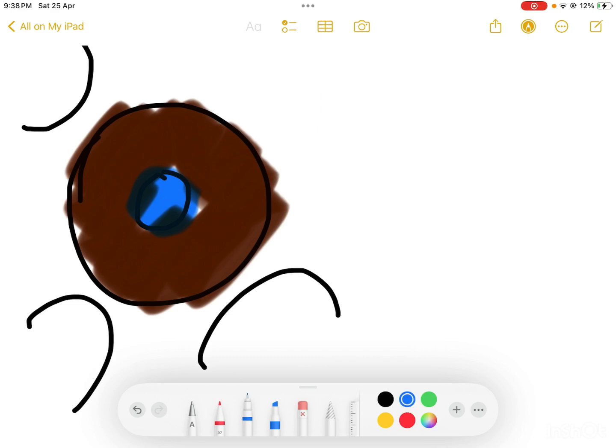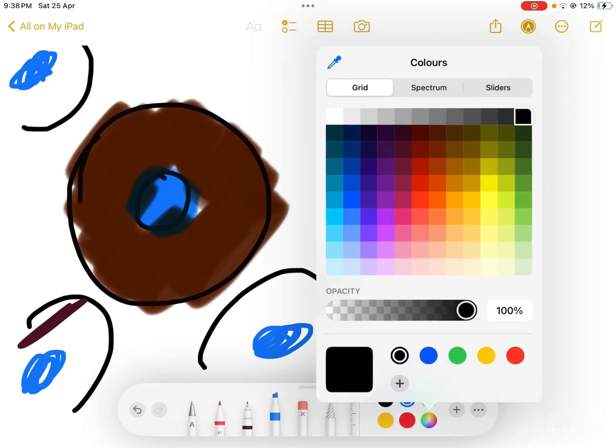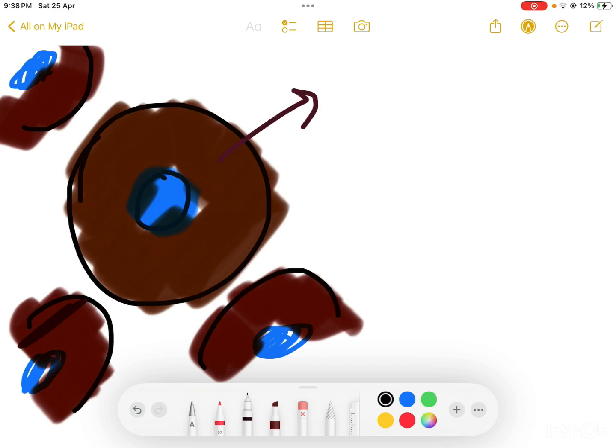So if there is a nucleus here, a nucleus here, a nucleus here, then you will see the cytoplasmic pattern. I was using this pen, sorry if it is irritating. So this is the cytoplasmic thing. So you will see the cytoplasmic IHC in this way. This color also is cytoplasmic IHC.